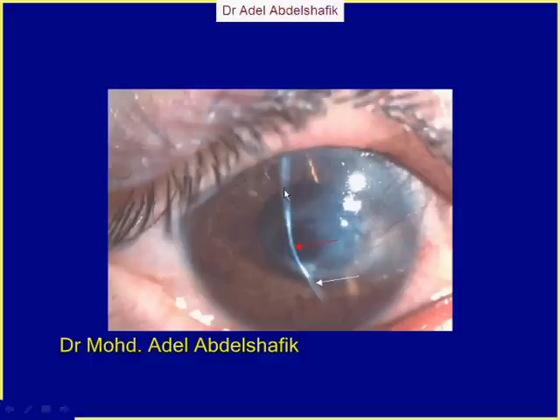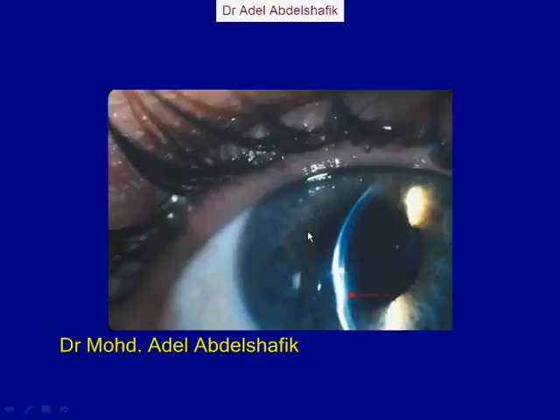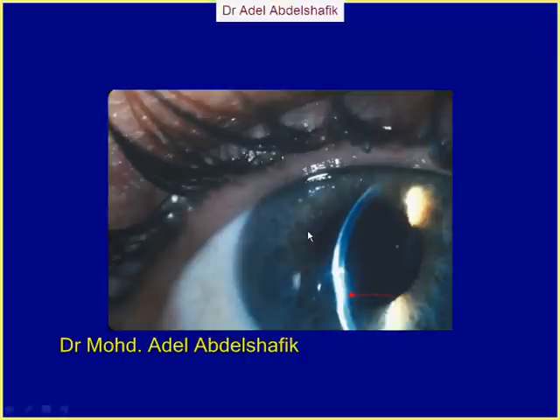And notice the curvature. So this is at least as curved at this part or slightly forward. So we get a thinning of this area of the cornea and it's slightly bulging.